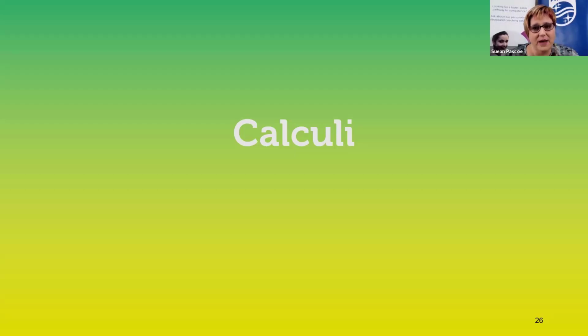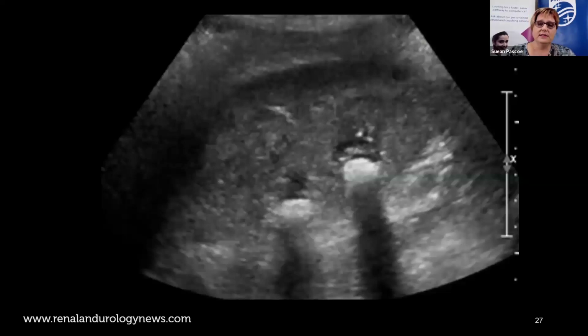So the importance here is that when you do think you've found a stone, make sure that it casts a shadow in both the longitudinal and the transverse plane. And the reason for that is because sometimes the echogenic central sinus fat can cause a bit of a shadow, which may be mistaken for a big staghorn calculus or something. But the thing with that echogenic sinus fat that might cause a shadow in the transverse, you can't see it in the longitudinal view.